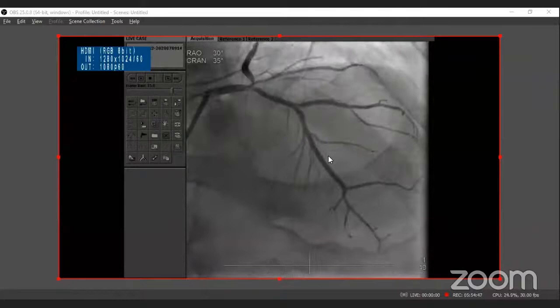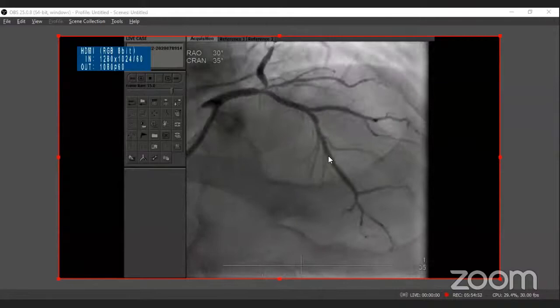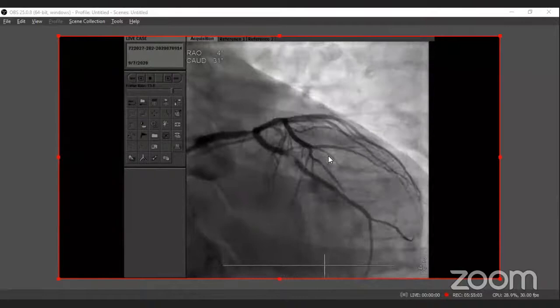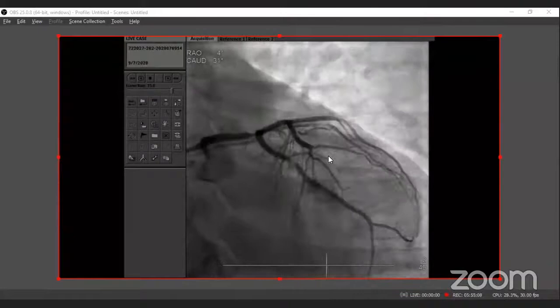Yeah. So the size, these are both 3.0 vessels from angiographically. So it's more favorable for Culotte. Angle wise, actually in this case, I may have preferred a crush technique for this one because the angle is about 90 degrees. So maybe it's better for a crush. But anyhow, for both techniques, it can be done.